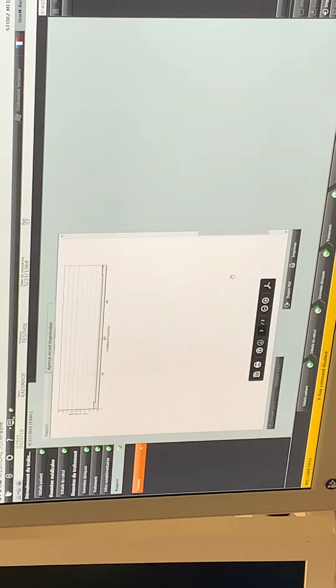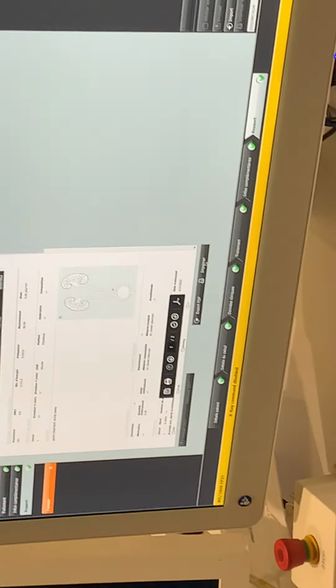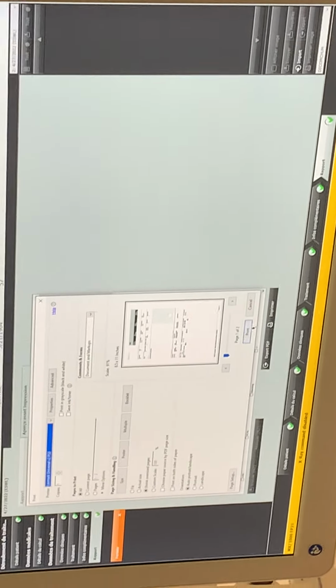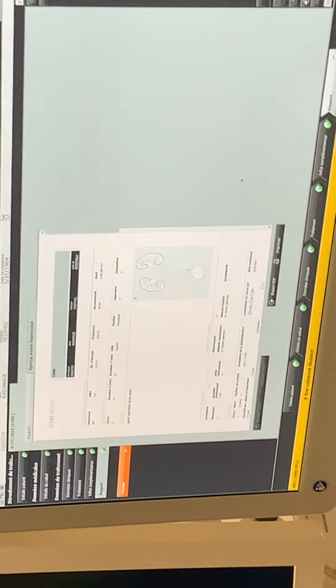Okay? We'll have to print the report for the chart. We're obliged for the referring physician for our charts. I will print the report now. Print, you need to have that Lexmark universal at the moment. What was Lieberman doing? He was printing every time. Printing, yes. We do not have any other possibility at the moment.